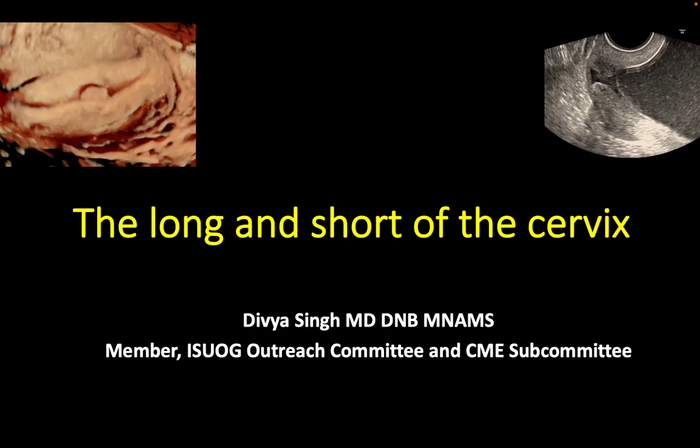Hello, everyone. It's been a while since we've had some teaching and learning in ultrasound, and this video will cover the long and short of the cervix. That is the application of ultrasound and analysis of the cervix in both obstetrics and gynecological practice.